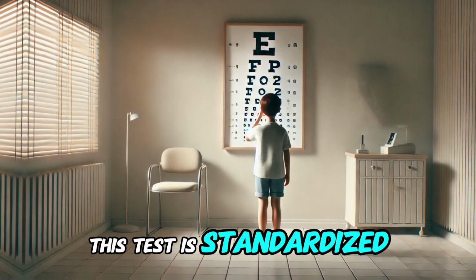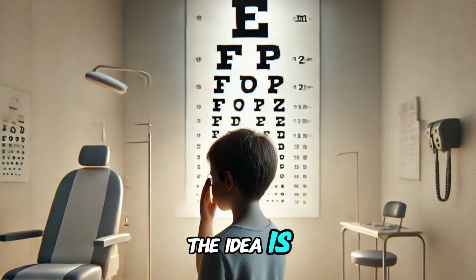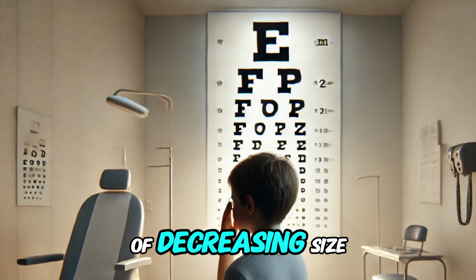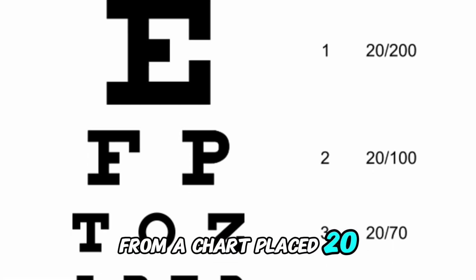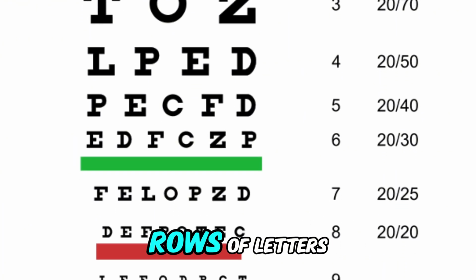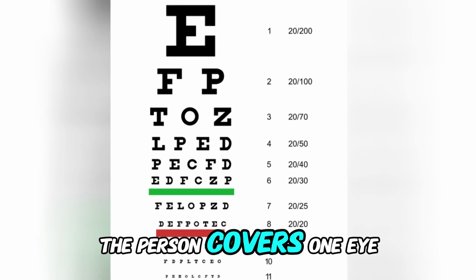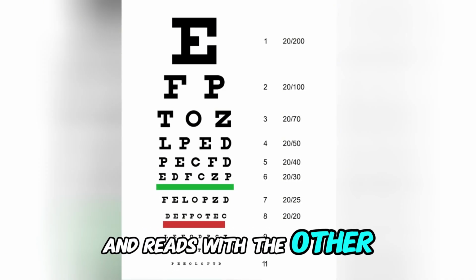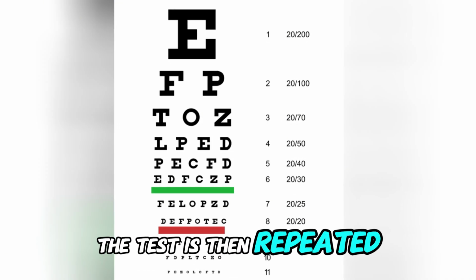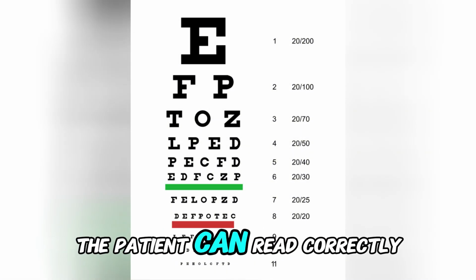The first and most commonly used test is the Snellen chart test. This test is standardized and the most widely used for distance visual acuity. The idea is that the patient reads letters of decreasing size from a chart placed 20 feet, about 6 meters away. The Snellen chart has 11 rows of letters that decrease in size from top to bottom. The person covers one eye and reads with the other. The test is then repeated for the opposite eye. The examiner records the smallest line the patient can read correctly.